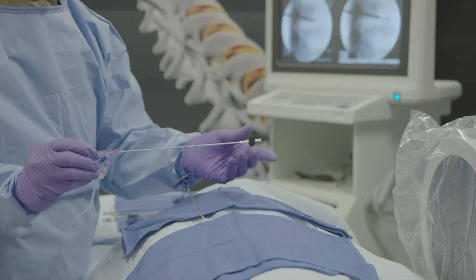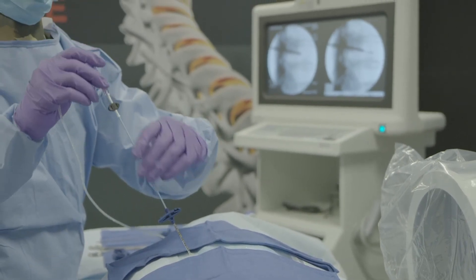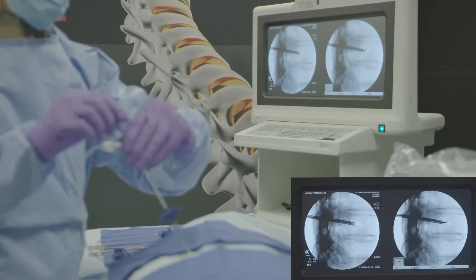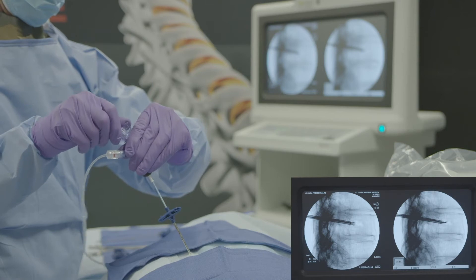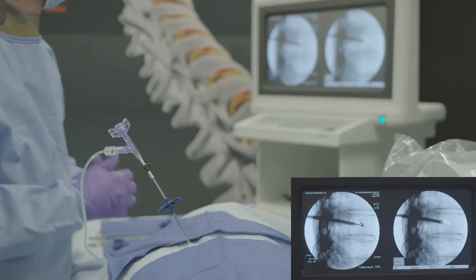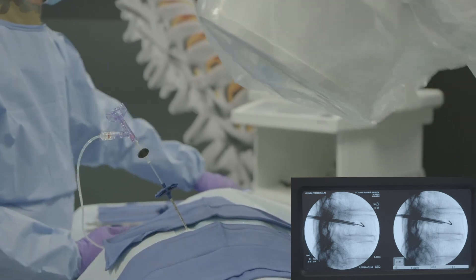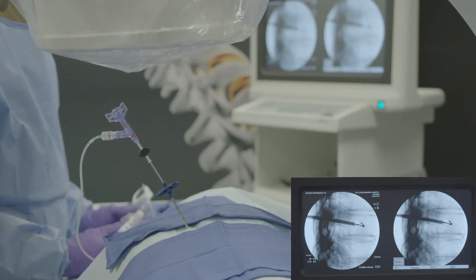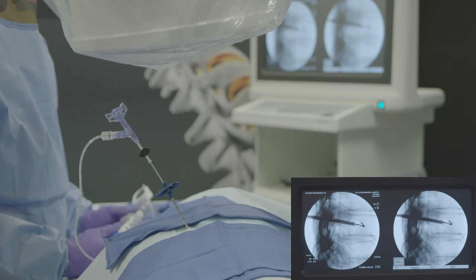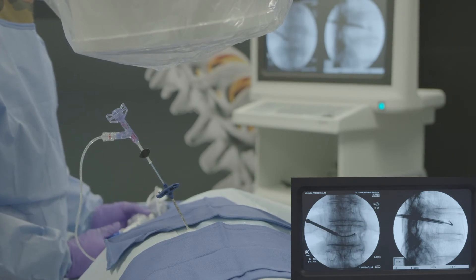The Arcadia balloon is equipped with a resheathing tool that can be locked into the hub. Do not remove it. In the lateral view, insert the Arcadia steerable balloon into the access cannula until flush with the distal tip. Begin turning the steering handle clockwise to aid in directing the distal portion of the device when the distal radiopaque marker of the balloon has exited the working cannula. Continue advancing the balloon catheter and turning the steering handle simultaneously to follow the access channel. The steering mechanism features a detectable hard stop when the maximum articulation has been reached.